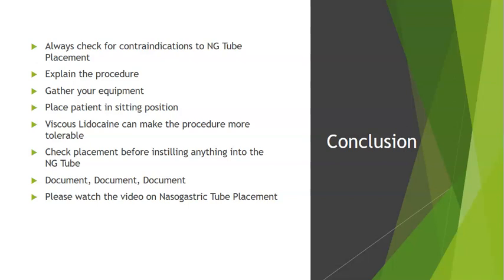And then following this PowerPoint, we do have a video where I'm going to be inserting a nasogastric tube on myself. So please watch this for nasogastric tube placement.